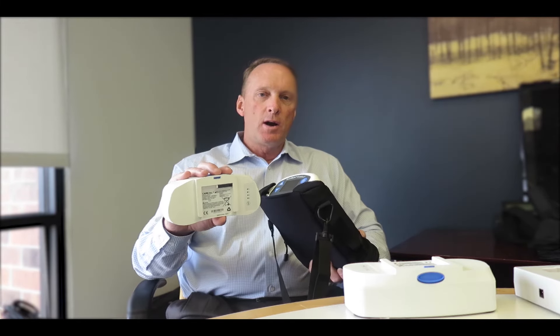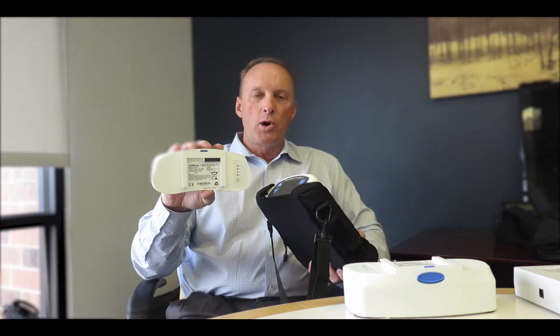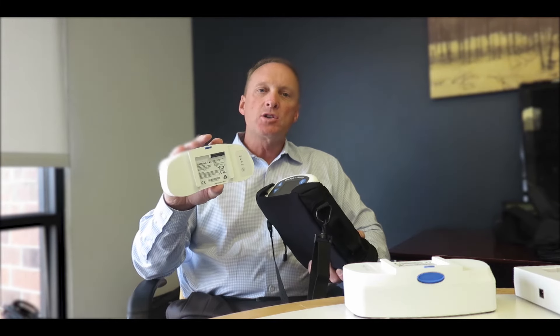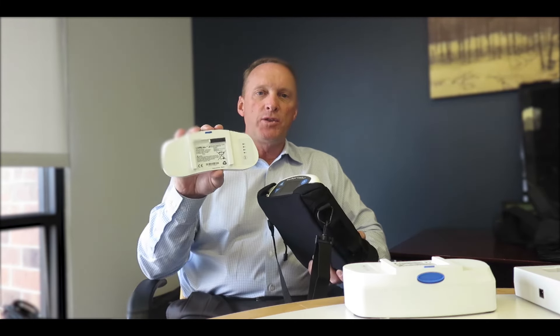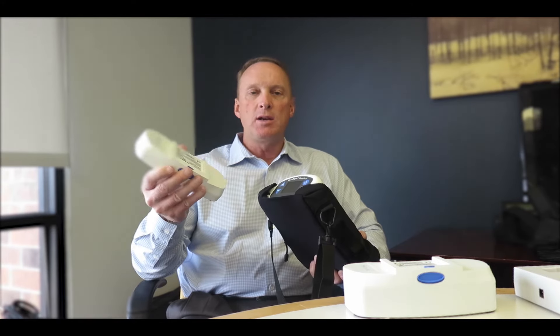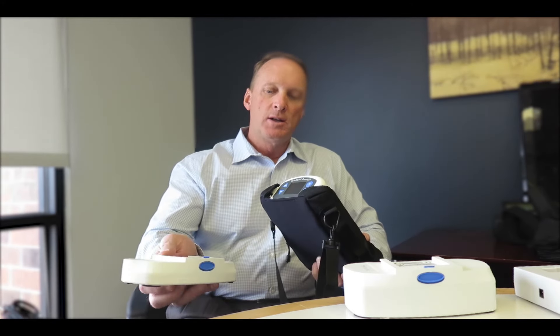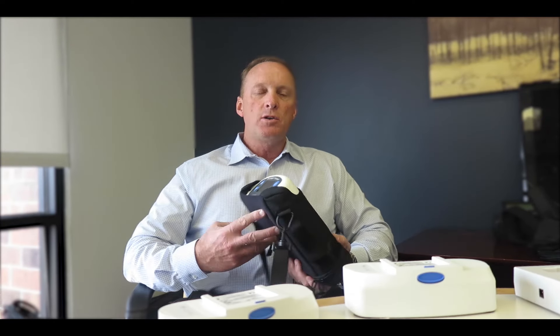Similar to your cellular phones or your iPhones, the battery won't just stop working after 300 cycles. It will actually just start to slowly degrade like your cell phone batteries. Test mode will allow you to go in and see with the patient how many cycles they have on their batteries, which gives you a great reason to upsell them for new batteries and make sure you understand what the battery performance is.